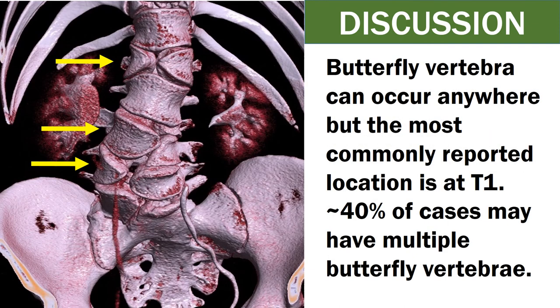Butterfly vertebra can occur anywhere, but the most commonly reported location is at T1. Around 40% of cases may have multiple butterfly vertebrae.